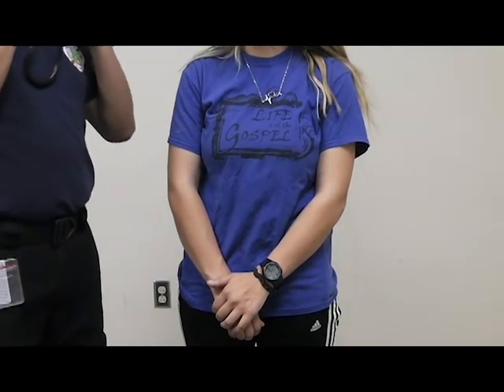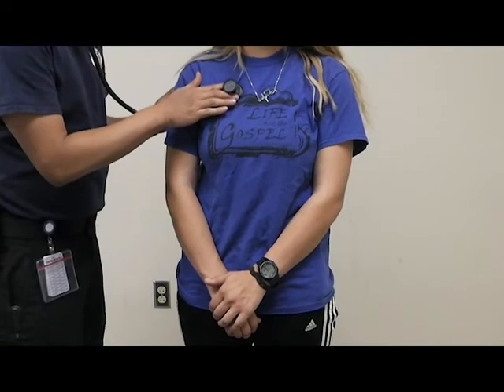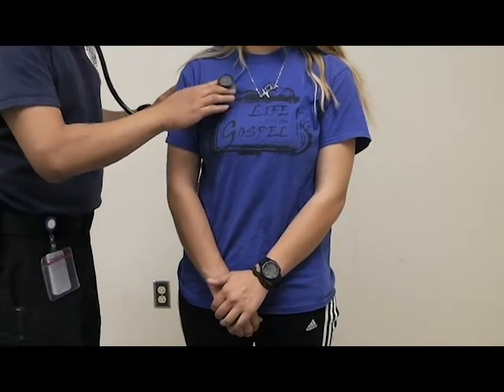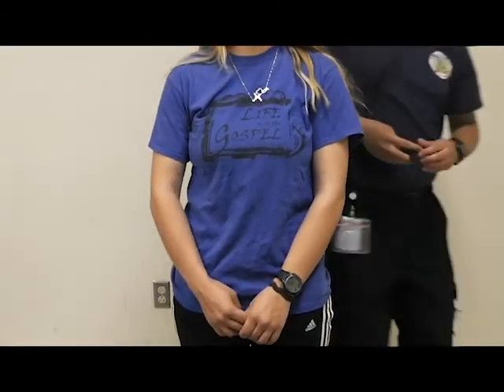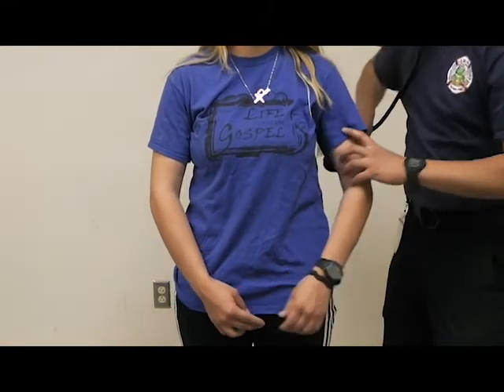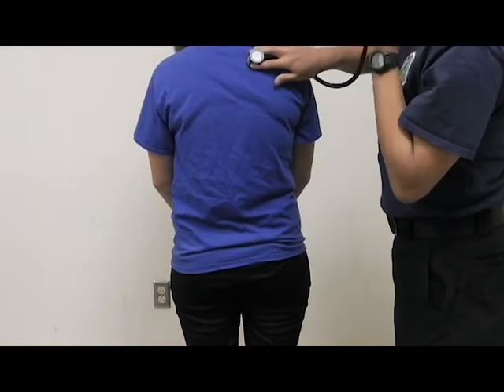This is a demonstration of lung sounds on a patient. When taking lung sounds, you're going to take at least six in the front and six in the back. You can also take lung sounds on the neck, anywhere there is airway. Place the stethoscope in, make sure you test it. Take one here, listen for breath sounds, and tell the patient to breathe in and breathe out. Check on each side, come around, check at the top and each side — avoiding the scapula.